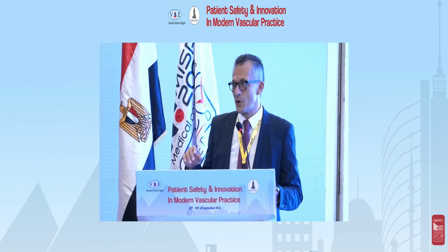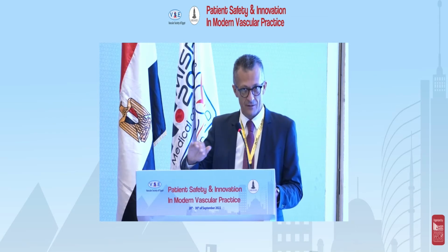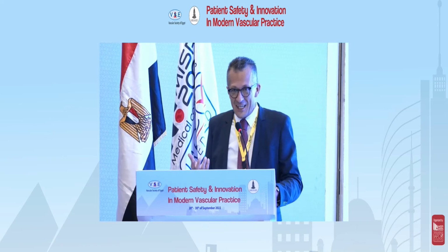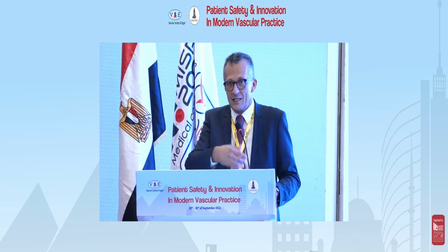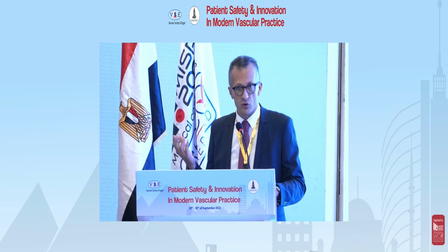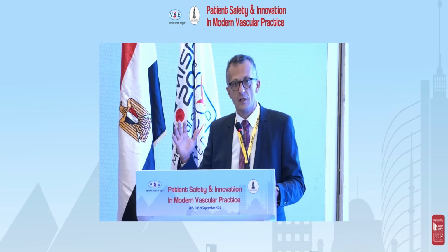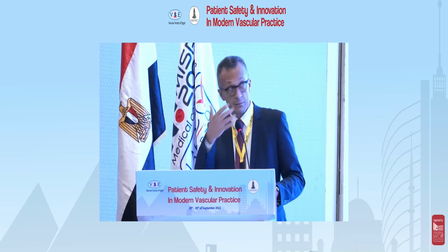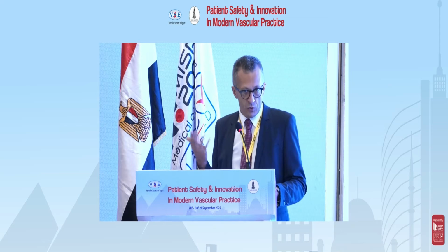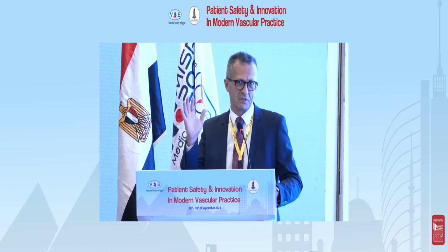The first thing is that when I use Rotarex, I never place a distal filter, because it's a thrombectomy device, first of all. Then I think the aspiration is really effective, better than the other atherectomy devices. But of course, the risk of distal embolization, also in the publications, is around 5–6% in the published literature. In my experience it was the same, probably a little bit worse, 7%.